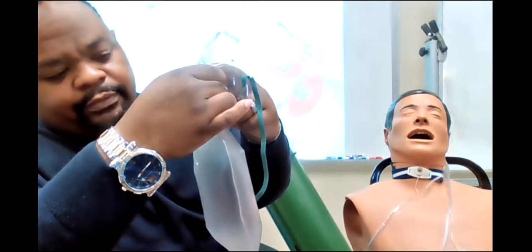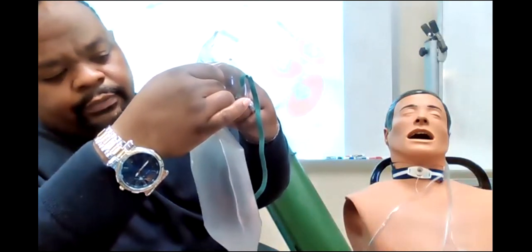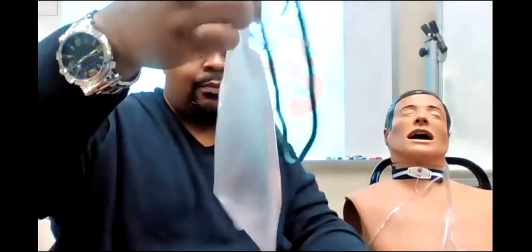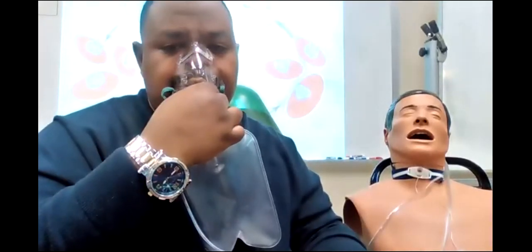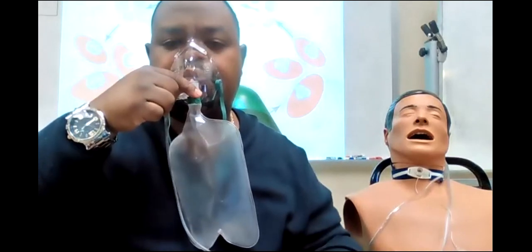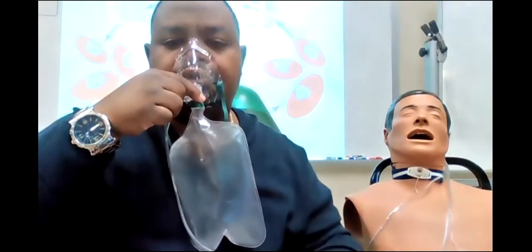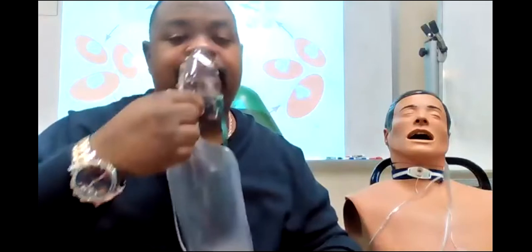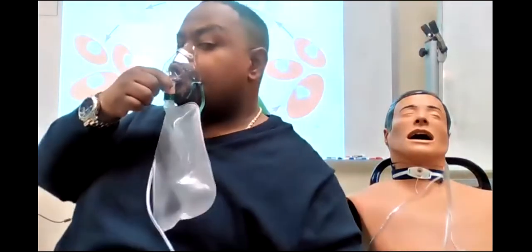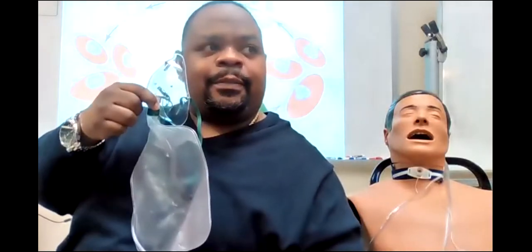Fill it up to start it out. All right, this is that non-rebreather mask. Now, if I take a really deep breath and try to collapse it, see that? If the patient is breathing like that and it's collapsing, you need to increase the flow.